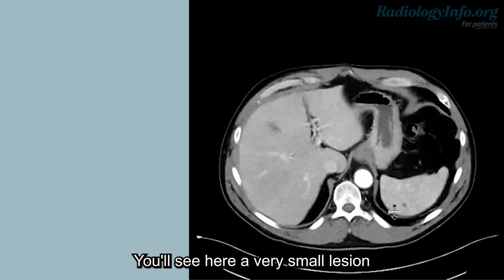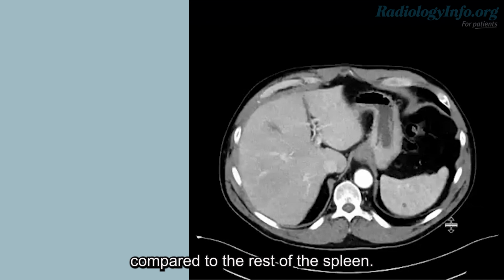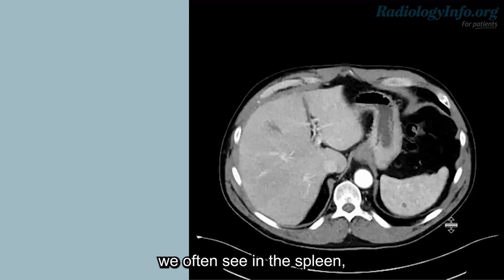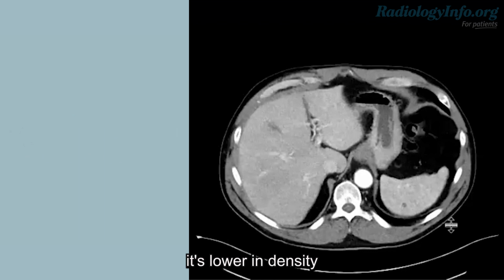You'll see here a very small lesion where my arrow is pointing to that is lower in density compared to the rest of the spleen. This is a very common finding that we often see in the spleen, the liver, or the kidneys, and we call this a hypoattenuating lesion. Hypoattenuating just means it's lower in density compared to the rest of the organ.